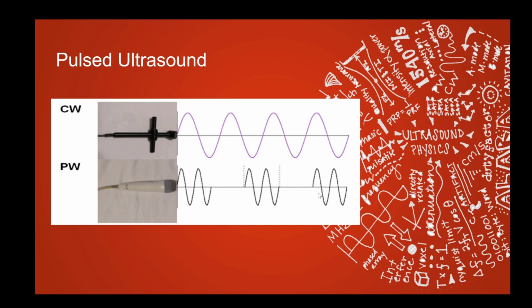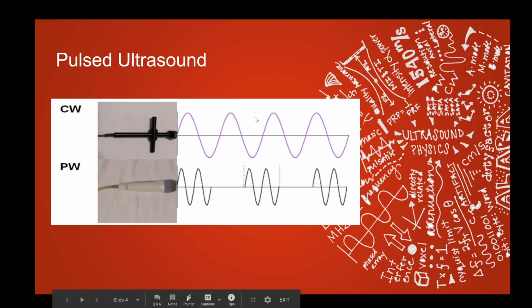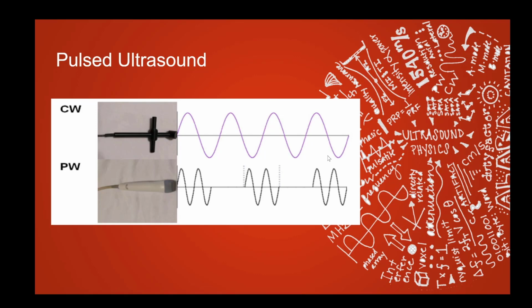Ooh, one other thing that you guys have to know, write this down somewhere. Continuous wave imaging, or continuous wave probes, do not create pictures. All right? Pulse wave do create pictures.